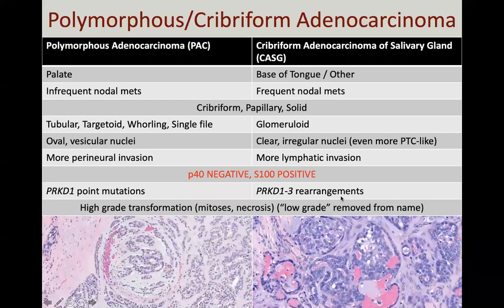Okay, so I have a lot of summary charts here, so you can review your morphology and clinical picture and immunoprofile of these salivary gland neoplasms.